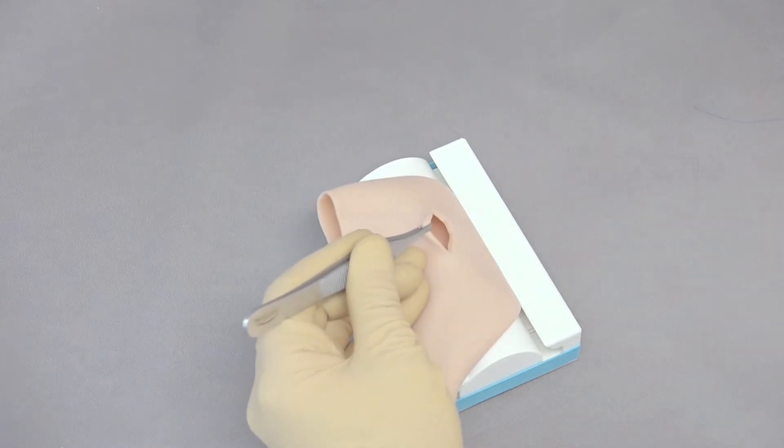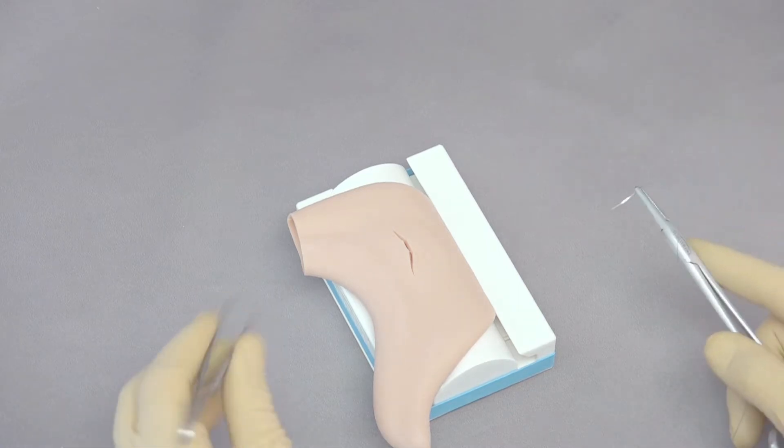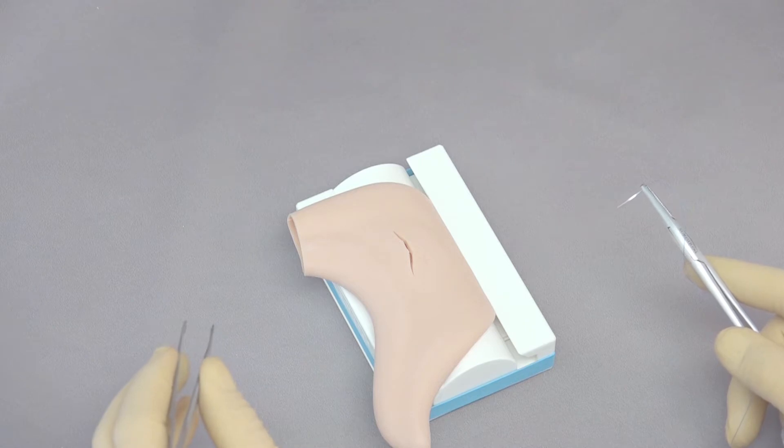We can clean out, explore the stomach, do whatever we need to do, and then we're going to close the stomach. Now in the vast majority of our species, a single layer closure is effective in closing the stomach. So we can just do a simple continuous through and through suture, in order to practice that.